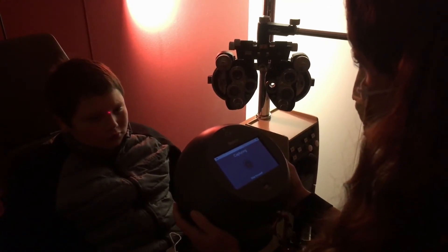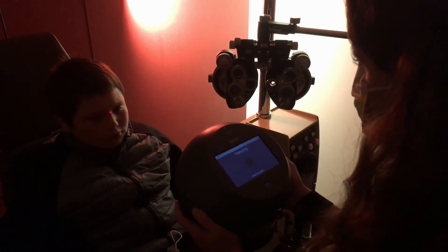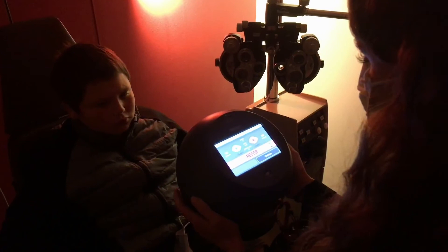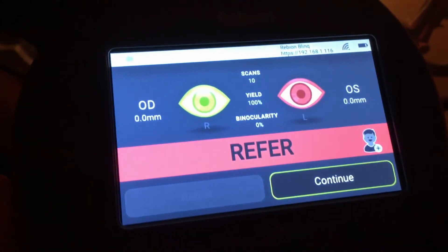Keep looking. Keep looking. Perfect. Nice job. Refer left.